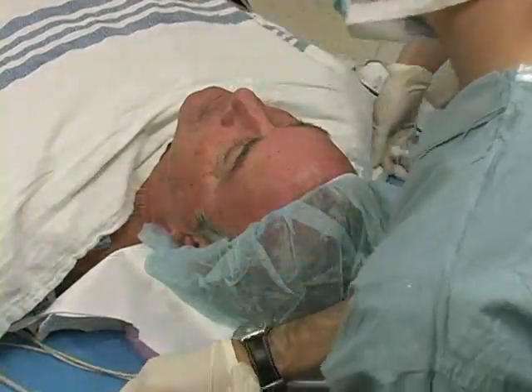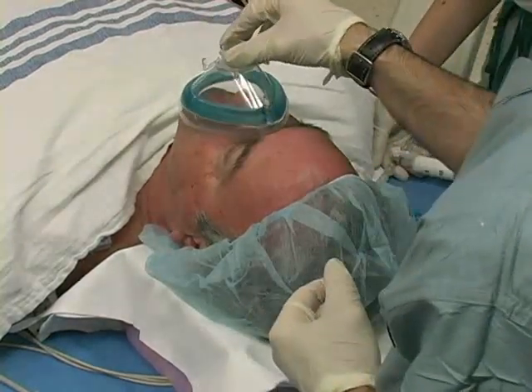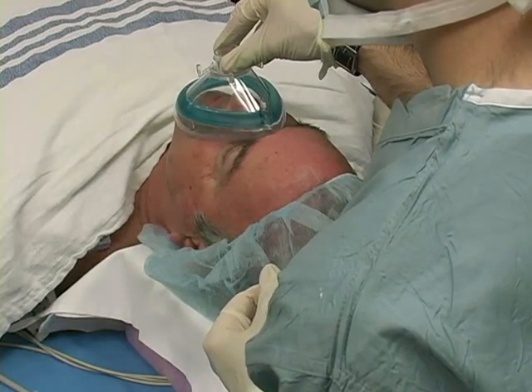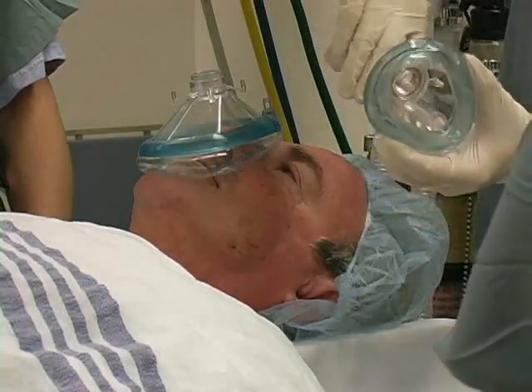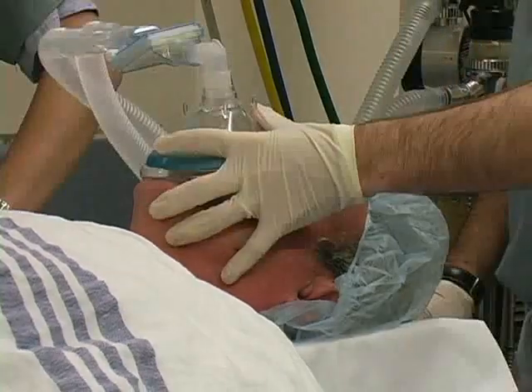Choose a face mask that best fits your patient. The mask should cover the bridge of the nose and the entire oral aperture. A well-fit mask forms a seal with the facial tissue. If the mask does not form a seal, add air to the inflatable cushioned rim to create a better seal.